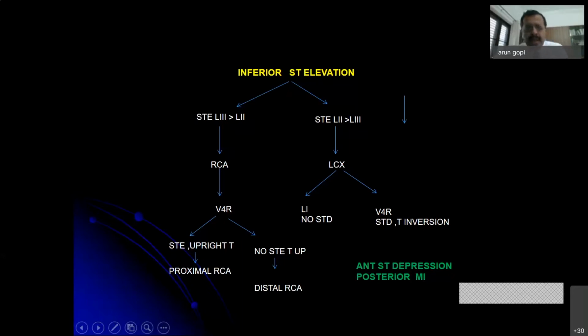We are always taught that ST elevation is an entity which is considered to be fatal and with ominous prognosis. You see this patient who came to us with significant angina and in a near hemodynamic compromise. On the contrary to what is expected, we find ST segment depression in all the leads, and if you have a close look, you can find actually ST elevation in 2 leads which we don't talk about much, that is AVR and V1. If you have this global ST segment depression with ST elevation in AVR, this is the worst form of myocardial infarction the patient can have, and that is why he is having severe angina with crippling hemodynamics. He has what we call a left main artery occlusion, and in this case, unless we immediately take him to the cath lab and open up this left main artery, this is a case with almost 100% fatality.